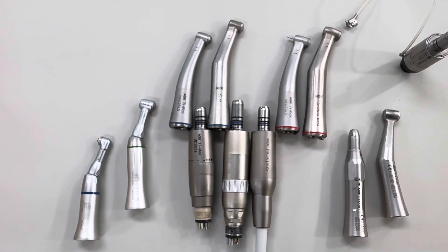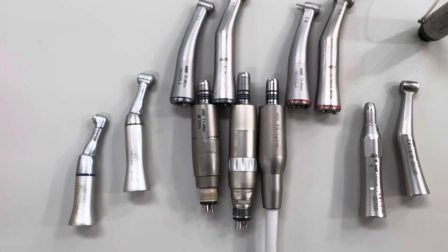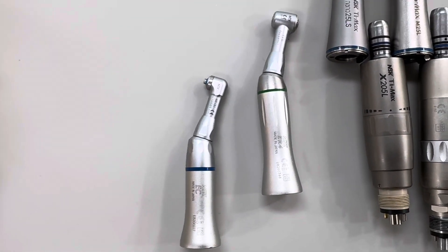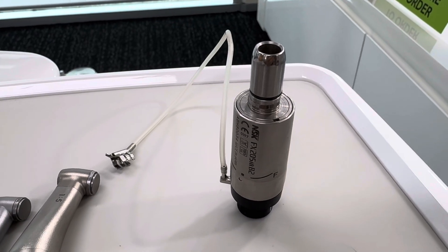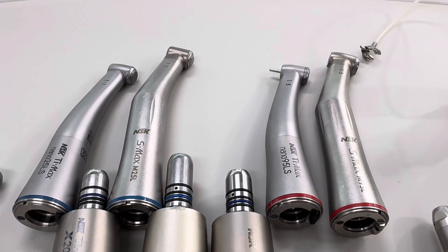The good thing about going to a motor with all the features and functions is they're in most cases backwards compatible. So if we go with all the top-of-the-line features, we can go all the way back to our most basic handpieces. If we start with a basic motor like this one here, which does actually have an option for external water, then we can use the basic handpieces, but we can't use the higher-end optical handpieces.